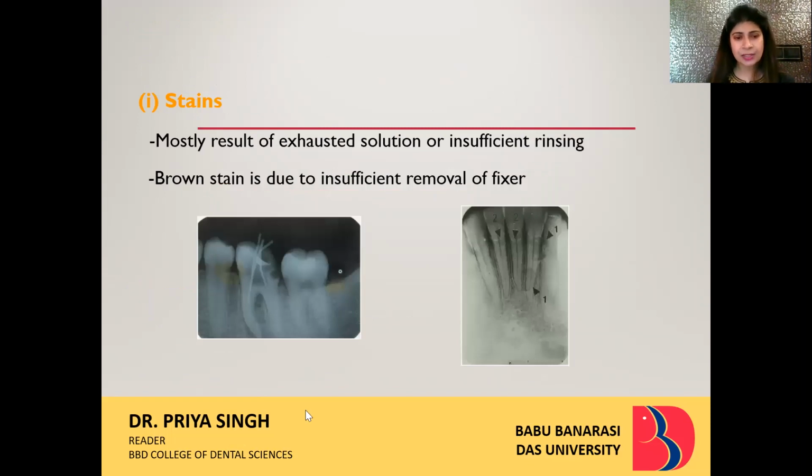Stains. As you can see here, it's brown color stains. The same happened here, brown color stain. It mostly results because of exhausted solution or insufficient rinsing.